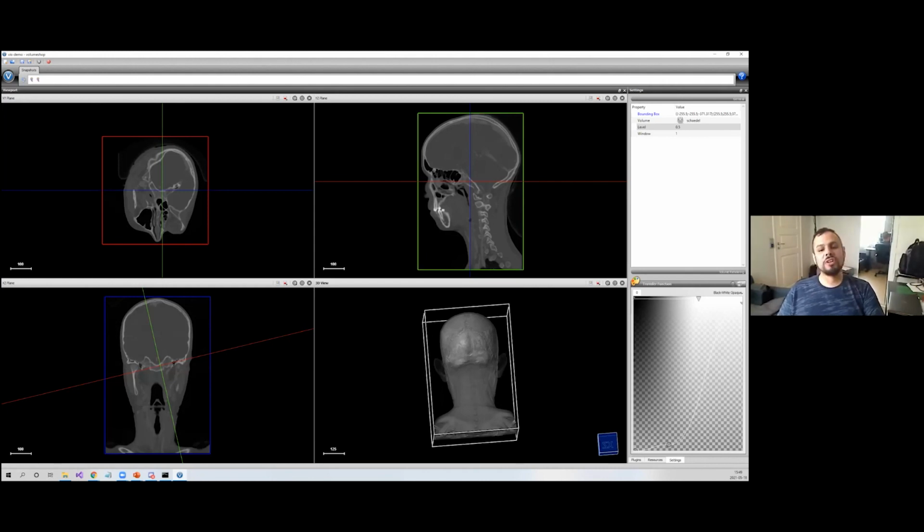So obviously also afforded by the advances in GPU technology, there has been quite some progress with respect to using more advanced optical models, and of course things like real-time ray tracing features on current GPUs can also be exploited for volume rendering.